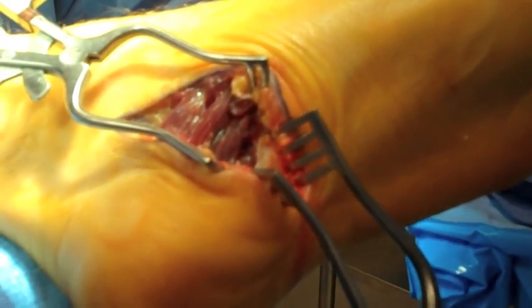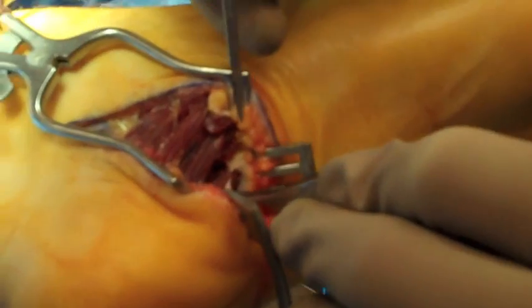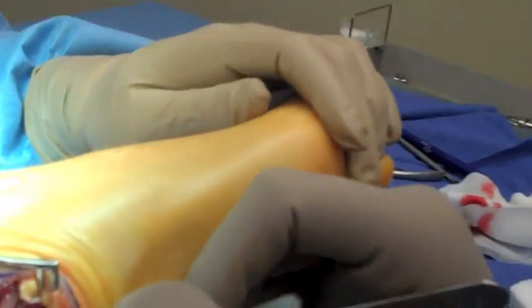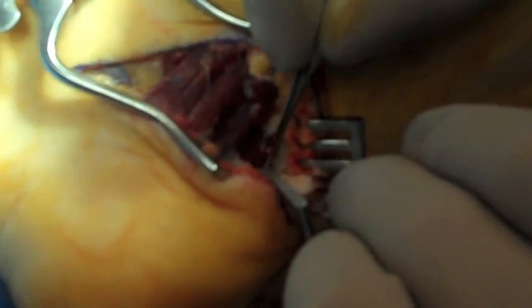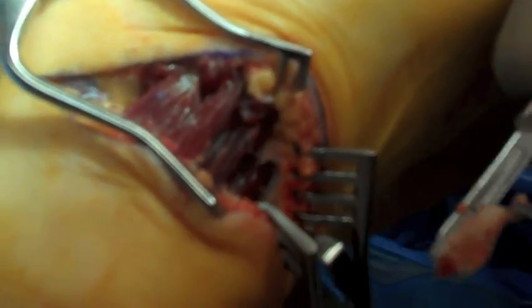Approximately a one-centimeter section of plantar fascia is then excised from the area, preserving the lateral band of the plantar fascia to help prevent lateral column pain, which is the most common problem with plantar fascia release. A section of plantar fascia is being excised with a 15 blade. This further helps to decompress the nerve and relieve the pressure in this area. The nerve in question is the first branch off the lateral plantar nerve. The plantar fascia is being excised and is typically sent for pathological examination.